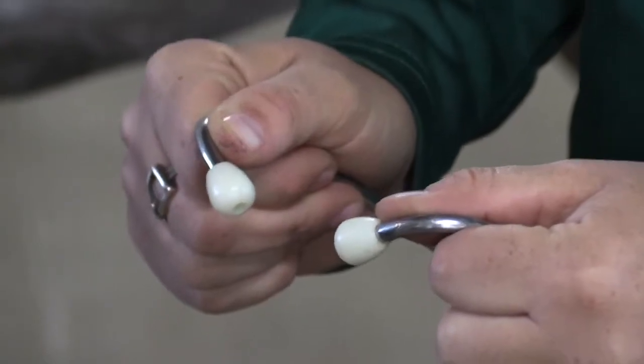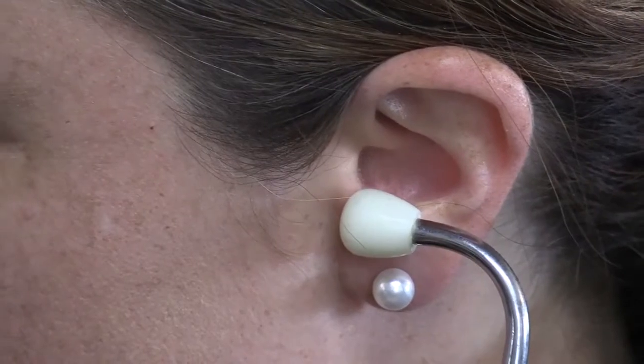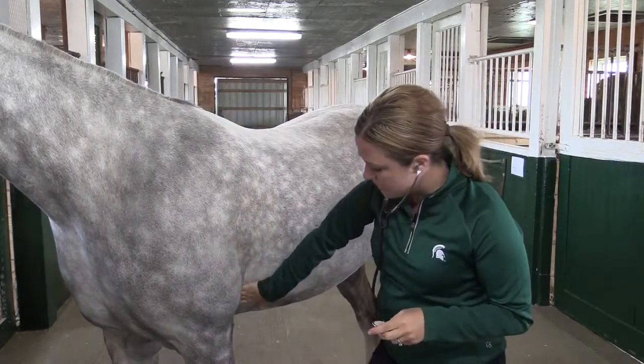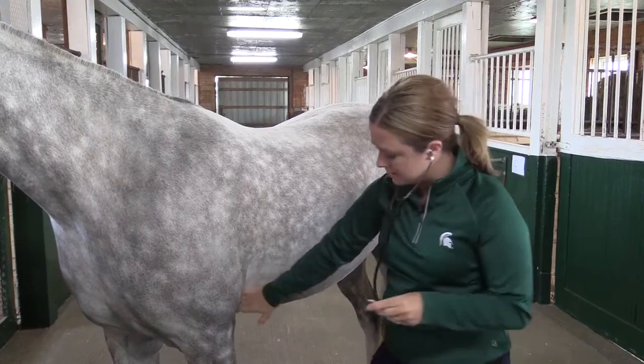I'm going to put it on with the ear portions pointed towards my nose when I put it on, and I'm going to want to put this right behind the horse's elbow against the rib cage.